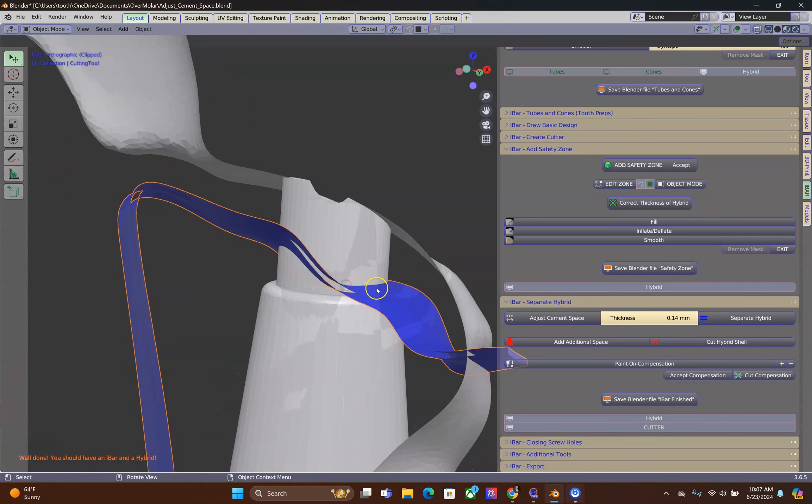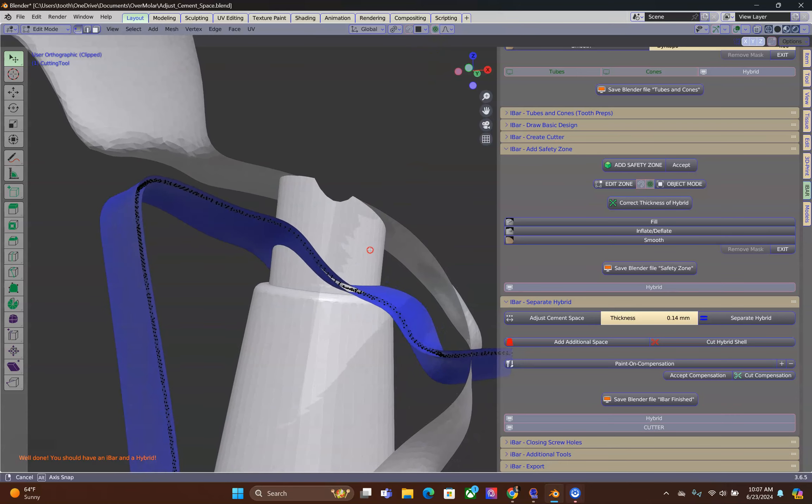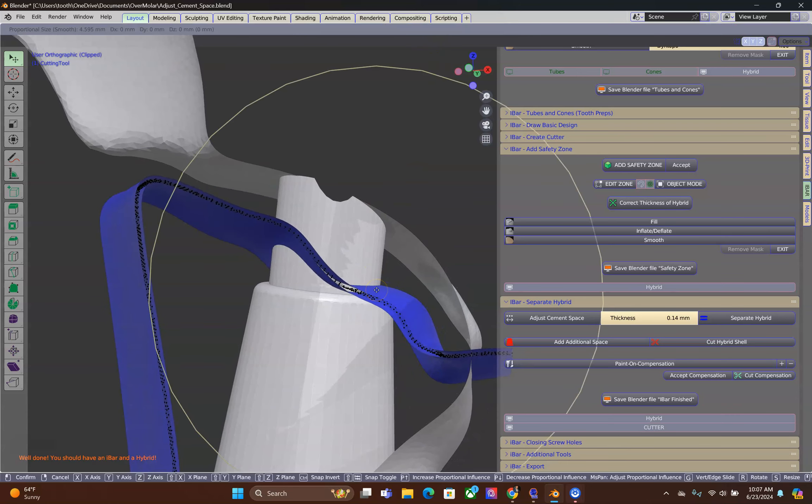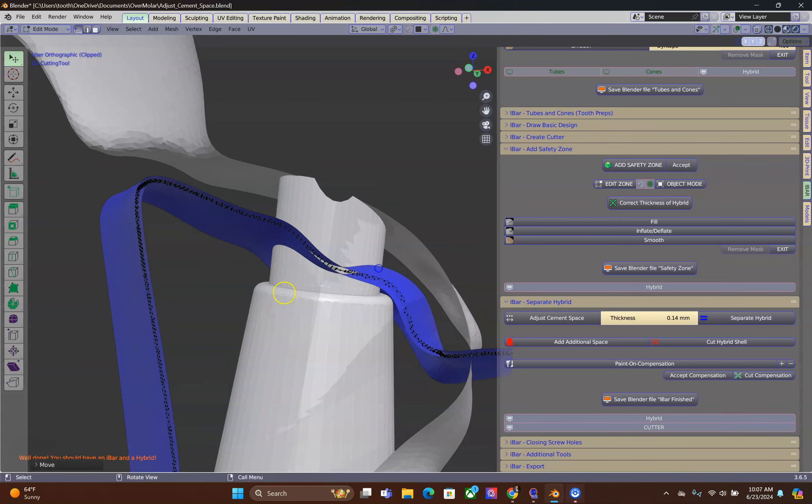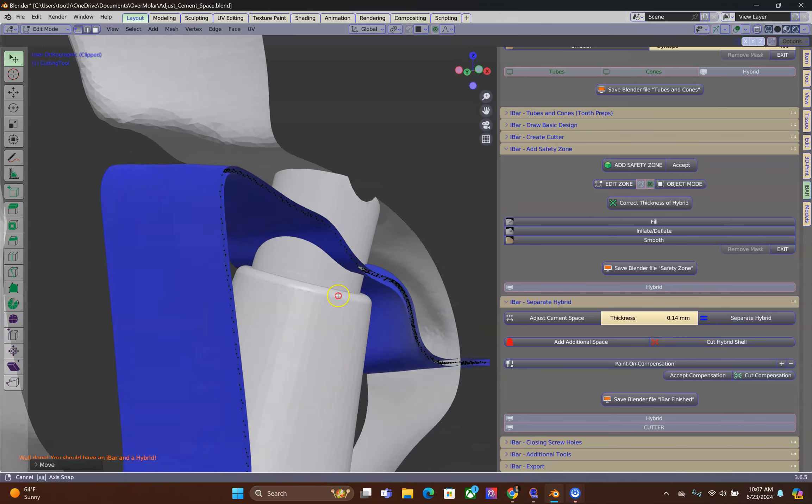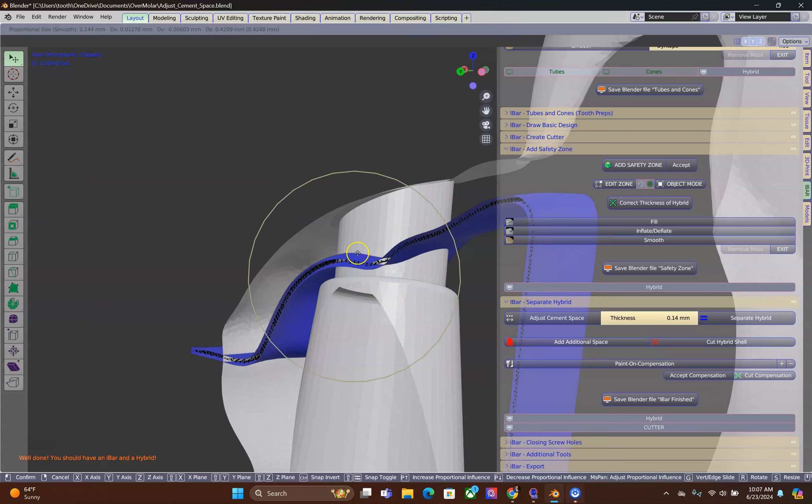Then, Tab to go into edit mode, select proportional editing on, use the G key and grab the cutting tool a little bit into a different location. Over here as well.